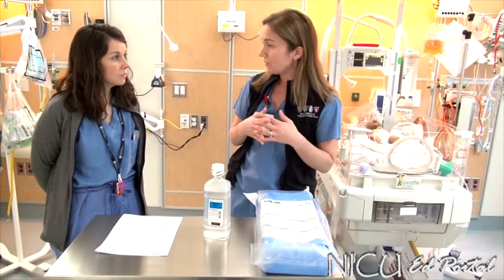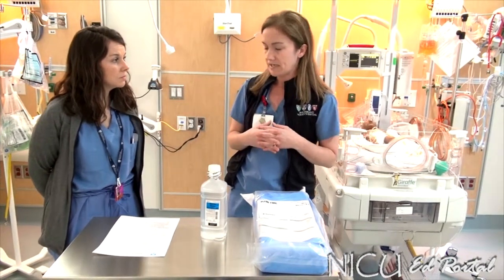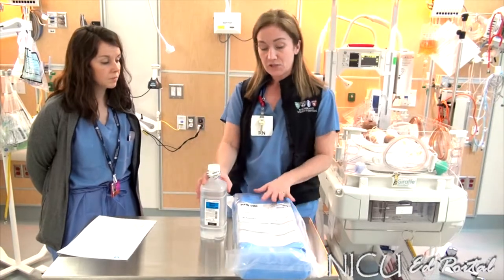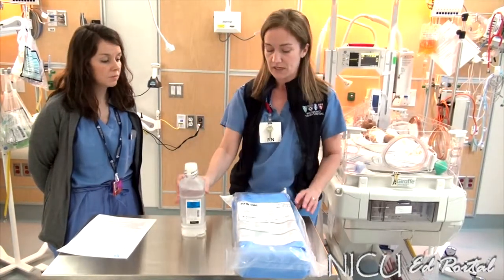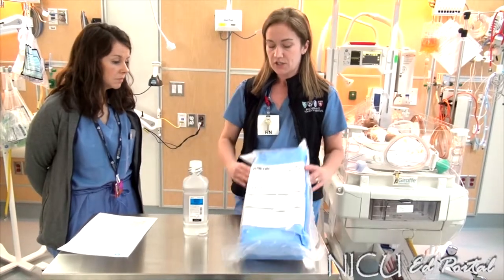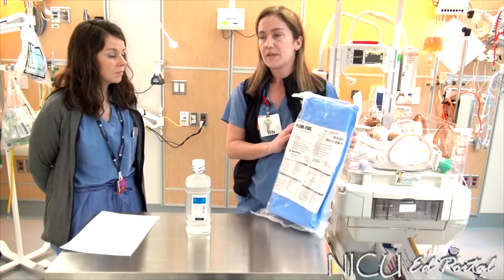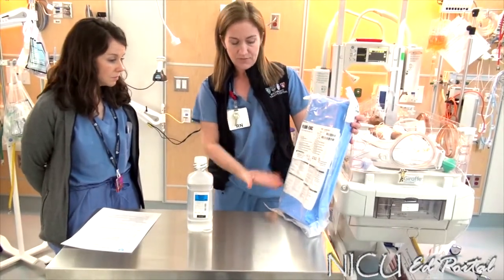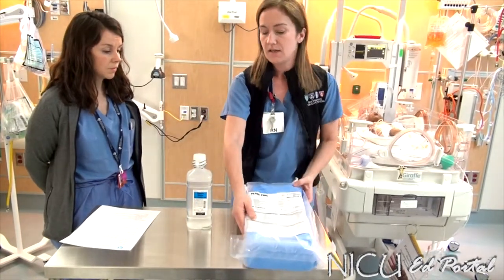Today we're going to walk you through setting this system up and make sure that you feel confident at the end of this training session. Gathering your equipment is actually a very straightforward procedure. You need your sterile water and you need the Pleur-evac Infant Chest Drainage Unit. This can be found in your neighborhood supply rooms.